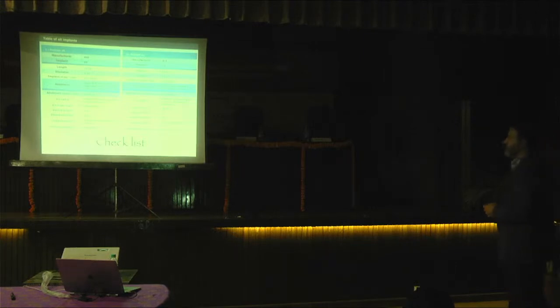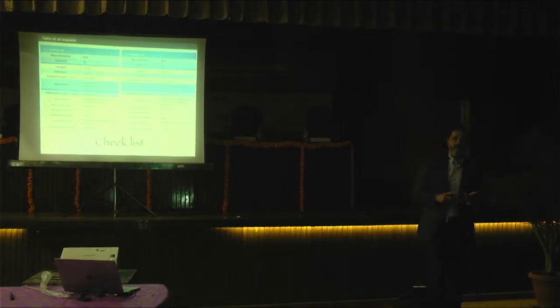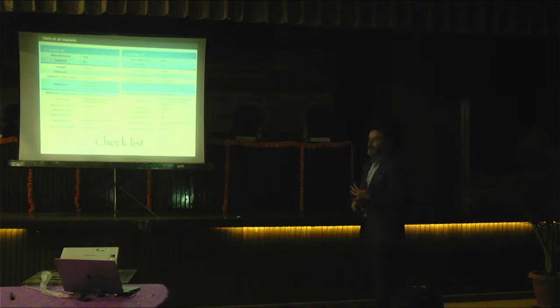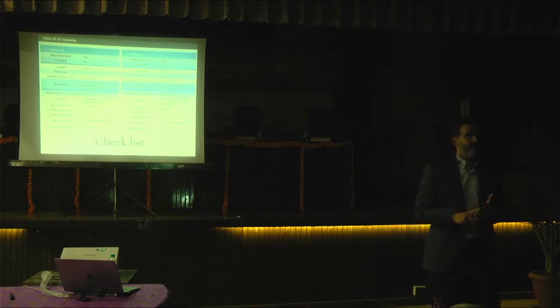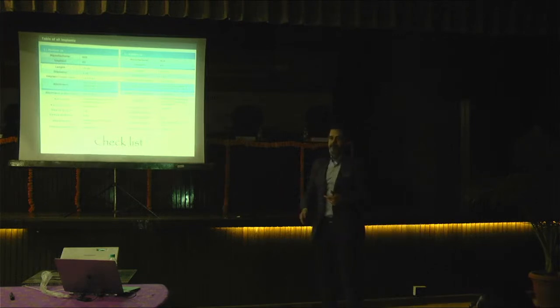once it's manufactured, the guide, we send you the guide, the industrial item. And with the guide, we send you a checklist. With the checklist, you can check which kit you're going to use, which implant brand. We said yes, we confirmed. The implant type, the implant width, the implant length, everything. And the guide and the kit and the set for everything needed in the surgery.